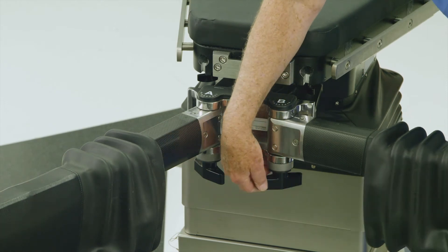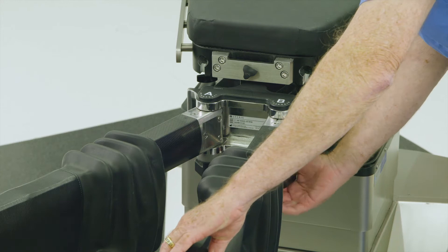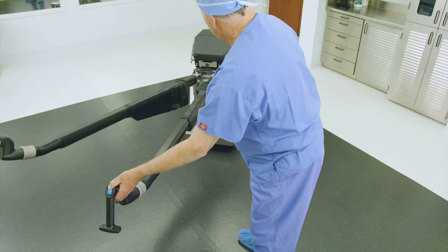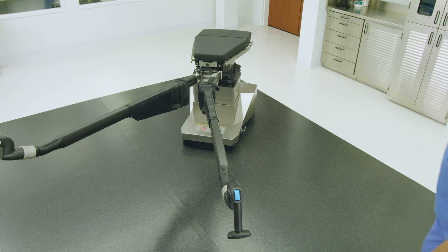Next, loosen the knob below the B rosette and set the B joint to position 3 or 4, and then re-lock the B rosette handle. Adjust the abductor spars using the control handles as shown here as clinically required, or refer to the illustrations on page 13 of the OT Table Setup Guide. Reverse these settings for an operative right leg procedure.